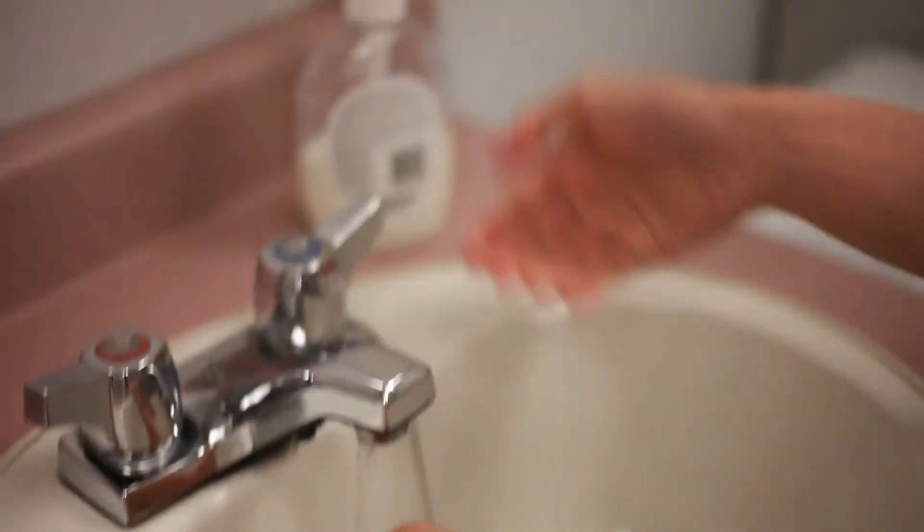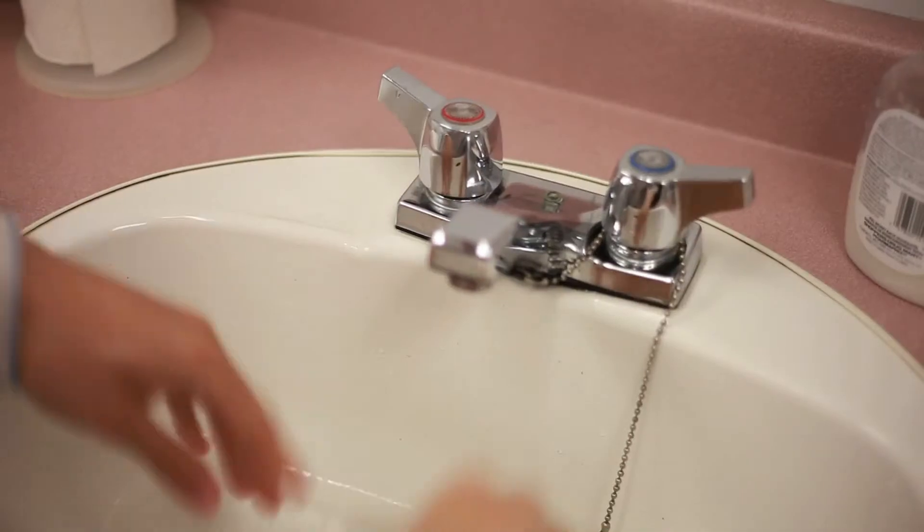The first thing you have to do before you test your blood is to wash your hands. You wash your hands for two reasons — of course for cleanliness, but also to get any bit of glucose off your fingertips, which might give you a false high reading.